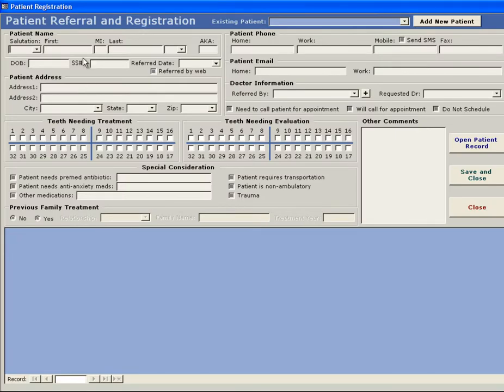Enter the patient's personal information. All that is required is first and last name, however you can fill out any additional information that you wish.